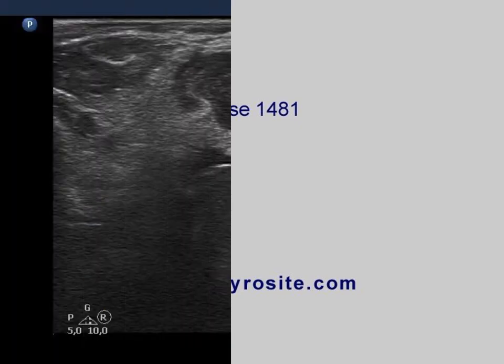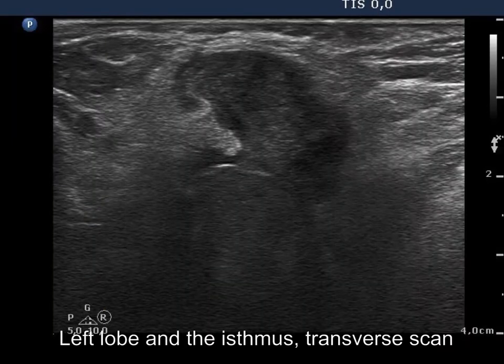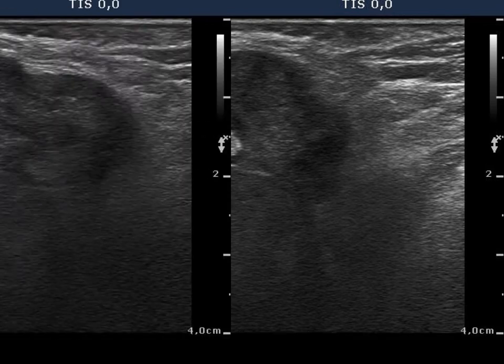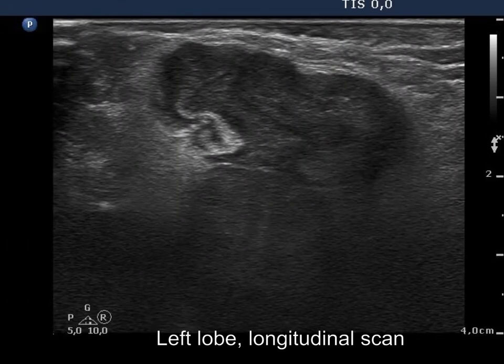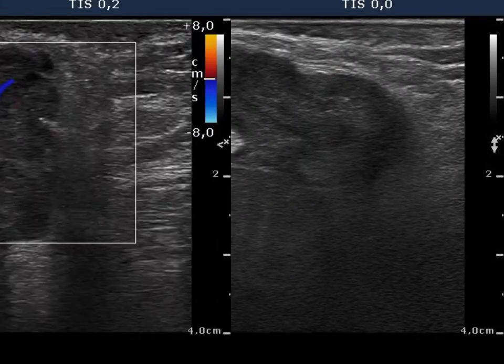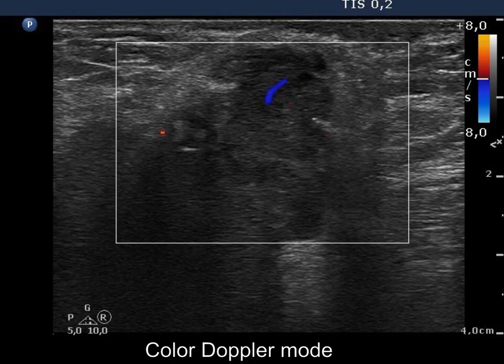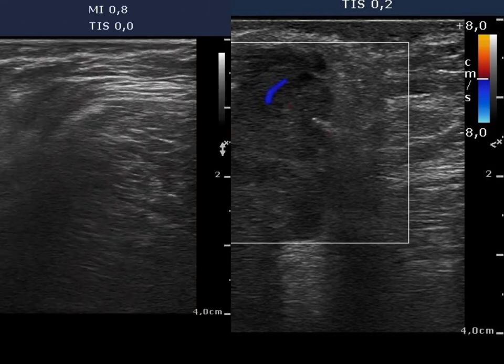The horizontal view of the left lobe in the isthmus is demonstrated. There is a large hypoechogenic mass. Now the tumor on longitudinal view. The vascularization is decreased.